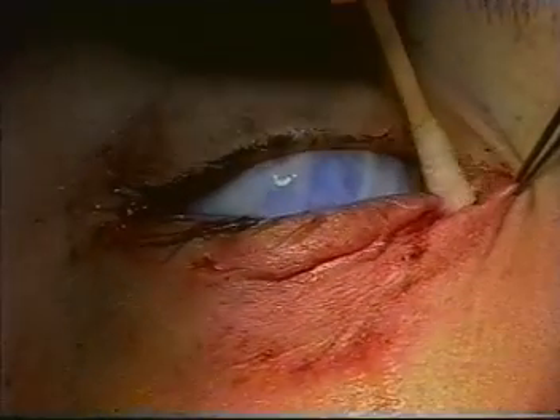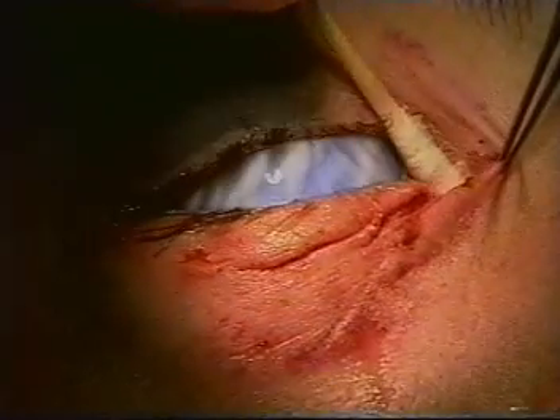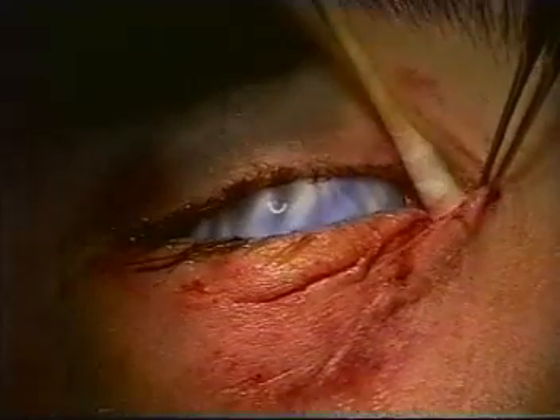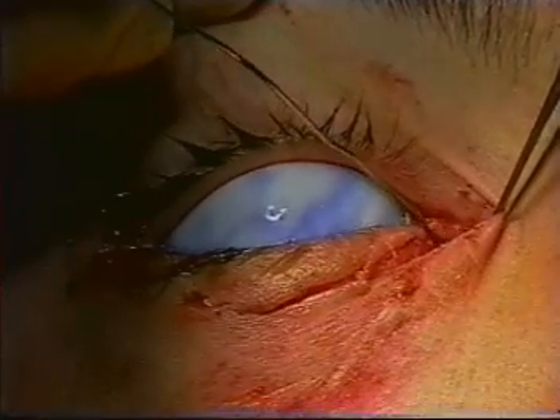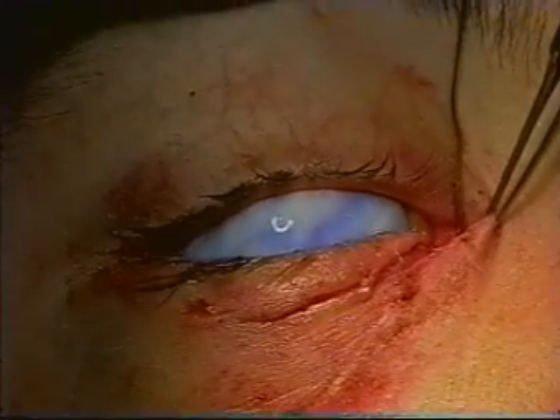Drying the area in the medial part of the canthal angle, it is possible to find the distal cut end of the canaliculus. The Bowman probe can be inserted into the cut end and gently manipulated into the lacrimal sac.